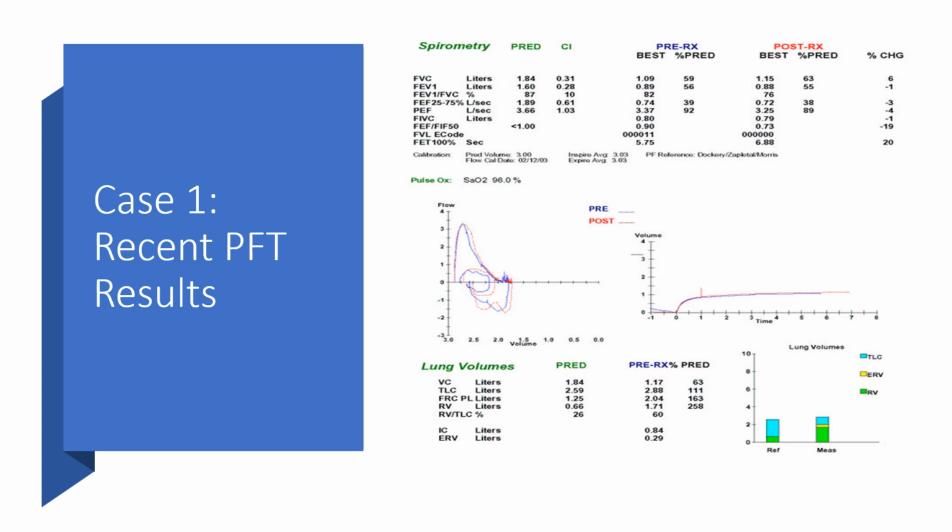Doesn't mean this patient shouldn't get bronchodilators. It just means that their underlying condition, CF, is not going to have a big reversible component, unless there's something like asthma superimposed on top of it. And then you have the FEV1 and the FEV1 percentage in the lines, upper right-hand side, in the lines beneath that. The percent change is negligible. In some cases, it's actually in the negative category. But really, the take-home theme is slightly positive, slightly negative, but does not respond to bronchodilator therapy.